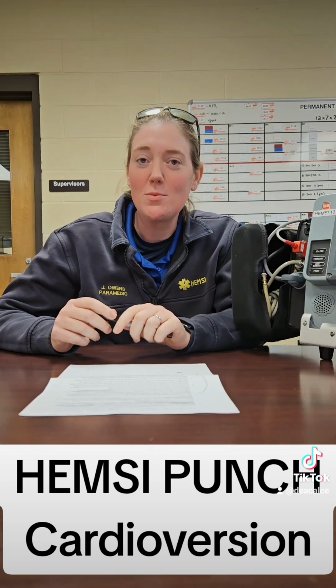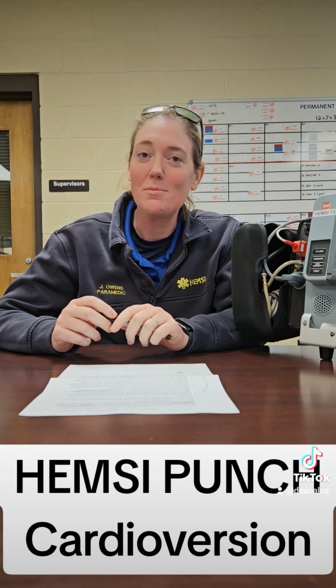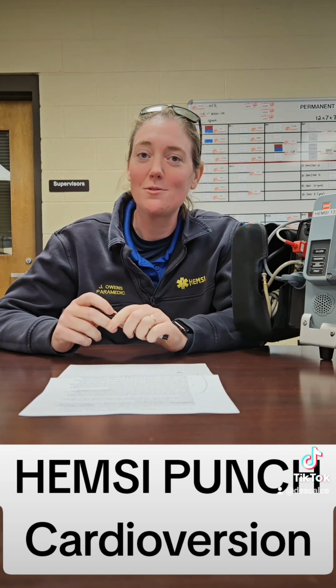When we have these patients, we need to make sure, especially if they're unstable, that we're not taking time to start IVs and to sedate them. The most important thing is going to be getting their heart back into rhythm.